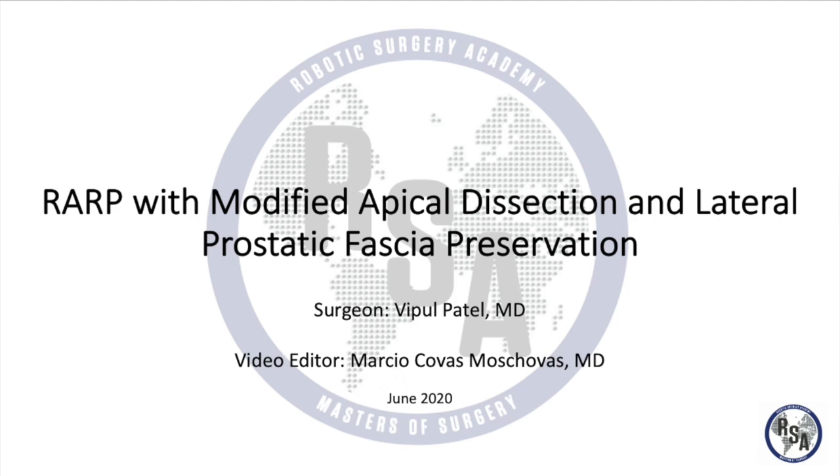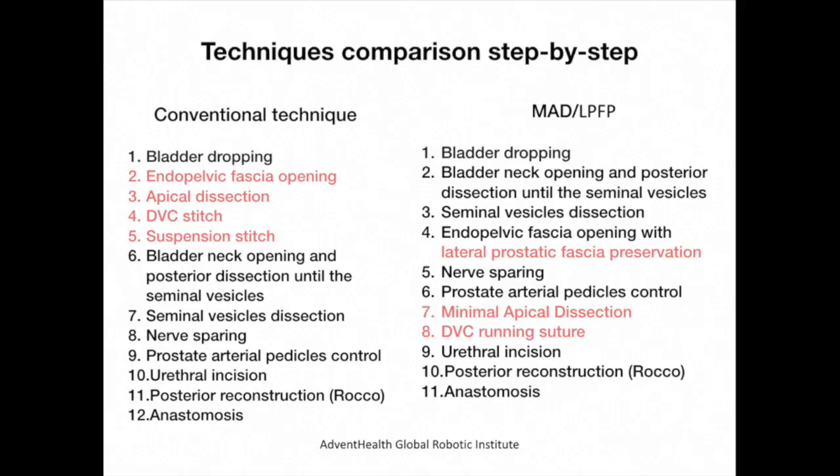Modified apical dissection and lateral prostatic fascia preservation improves early postoperative functional outcomes. In this video compilation, we will describe step-by-step the evolution of our conventional robotic prostatectomy after 10,000 cases. We divided this video presentation into four key steps to compare the differences between both techniques.